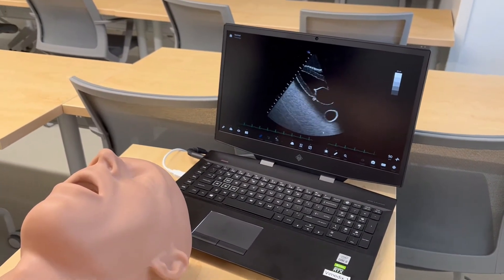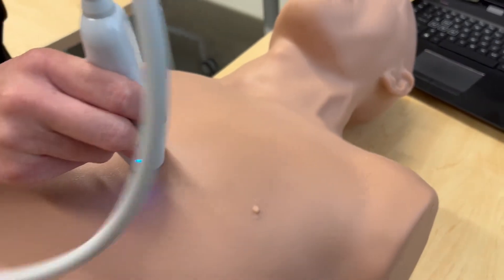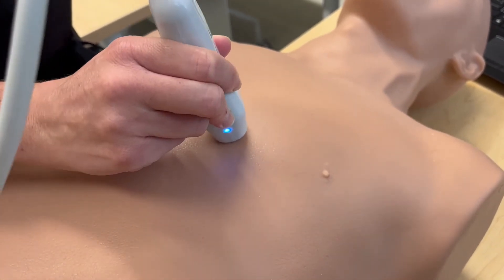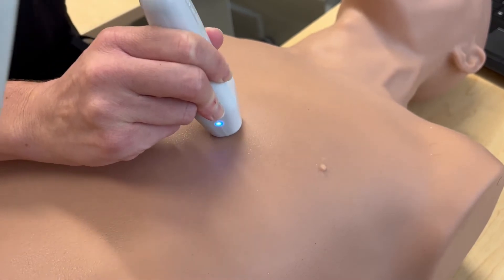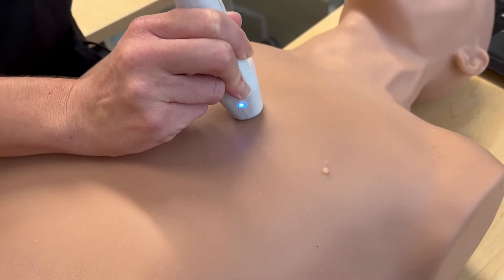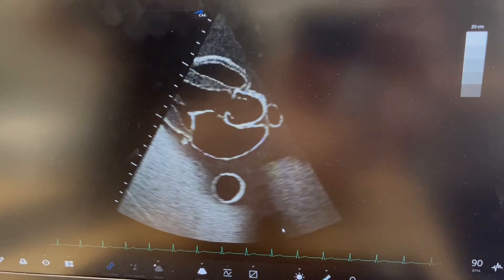Once you do find the heart, it will take some small adjustments of the probe in order to obtain the view that you're looking for. Ultimately, this is the view we want to obtain for the parasternal long axis view.